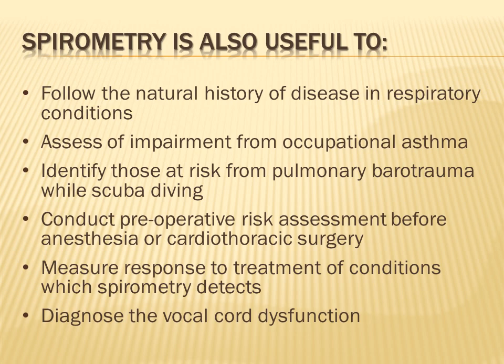Another usefulness of spirometry is to assess impairment from occupational asthma. Many workers in many factories will come and complain of asthma due to the dust in these factories, and to assess if they really have an impairment or an asthma because of occupation, this will be decided by spirometry. Spirometry is also useful for those at risk from pulmonary barotrauma while scuba diving.